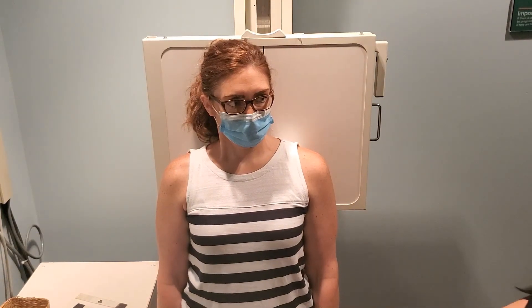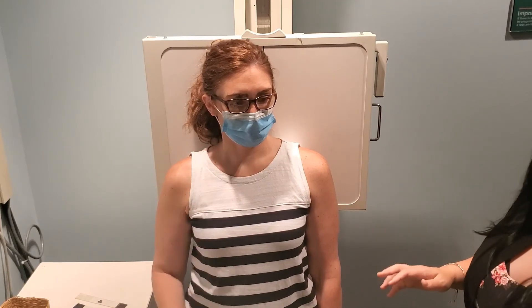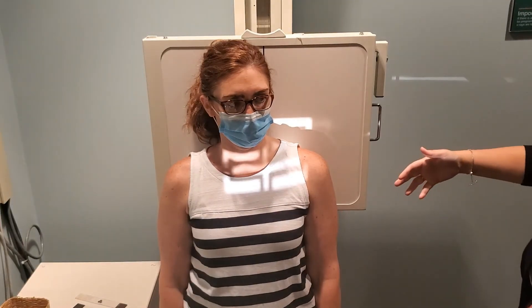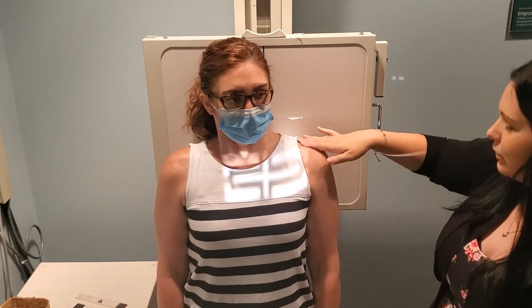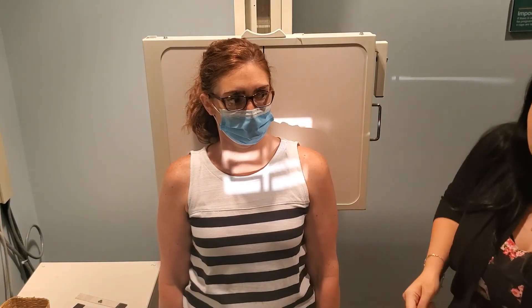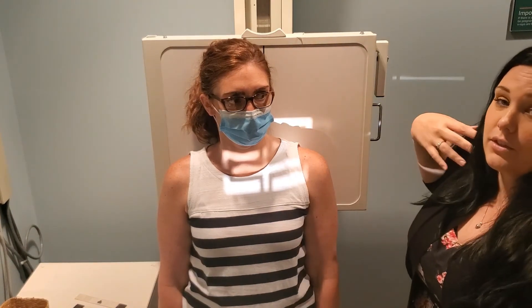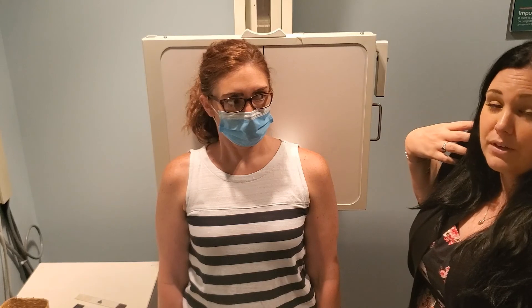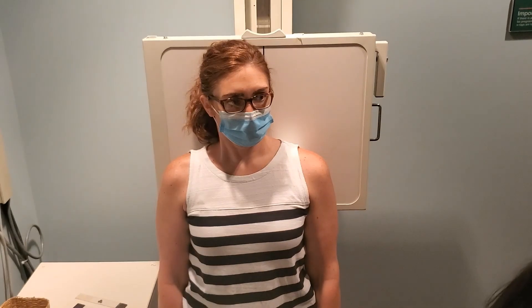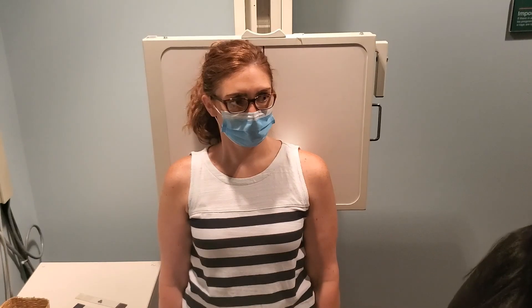Anytime you're working with a patient, tell them the breathing technique before you do it. If the patient is mid-breath when you give the instruction, they'll run out of air. Tell them ahead of time: 'I'm going to have you take a deep breath for this image.' Did you notice her shoulders went up quite a bit? A lot of people do that, and you don't need to. If a patient starts to do that, put your hand on their shoulder to help keep them relaxed, because if the patient brings their shoulders up, your CR will be off. Just be really mindful of these little details — this image isn't too hard to perform, it's just these small things that students struggle with.